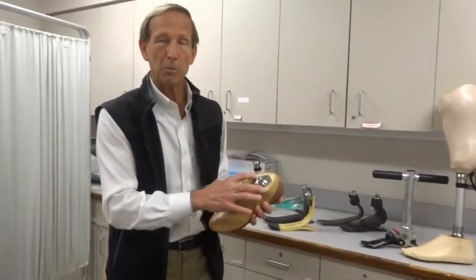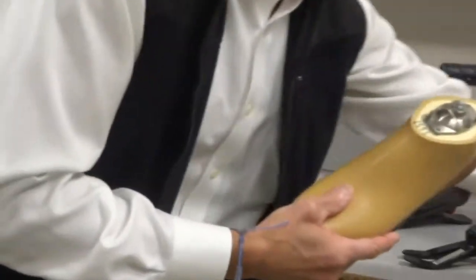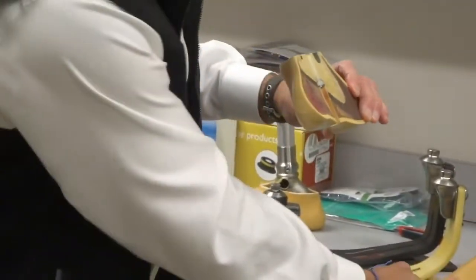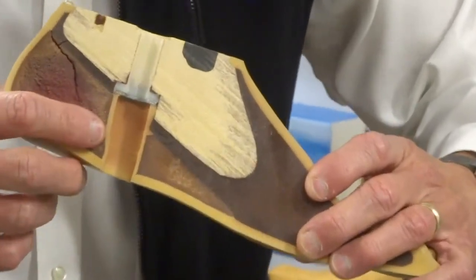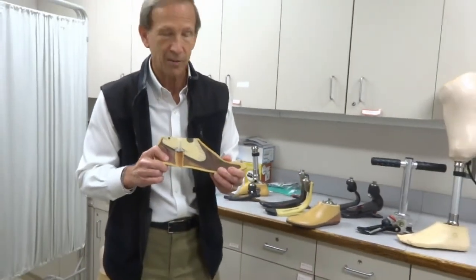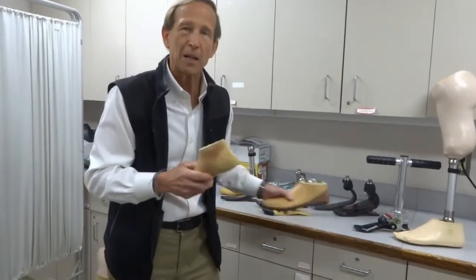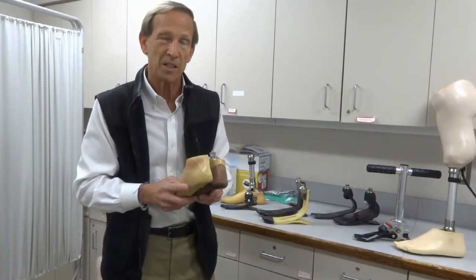For the lowest level patient who's only going to walk around their house on a level surface — a category one patient — they can get a very simple, very lightweight, and inexpensive type of foot. That might be one that is literally a wooden block covered in foam. A cutaway shows it literally is a wooden block with a piece of foam. It doesn't mean it's a bad foot — it's very light, very simple, and very low maintenance. The front half has a little bit of bend to it because it's rubber, but the rest is basically one solid block.